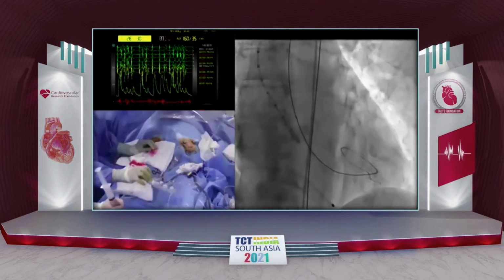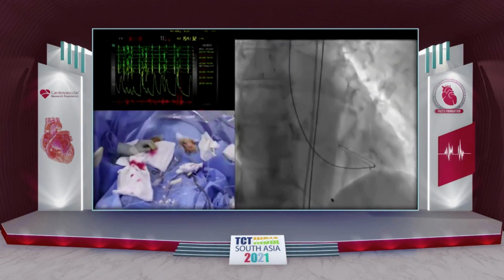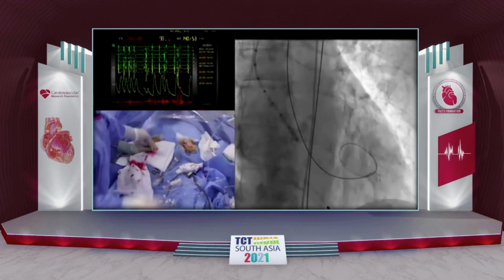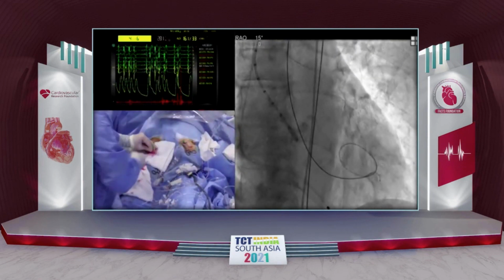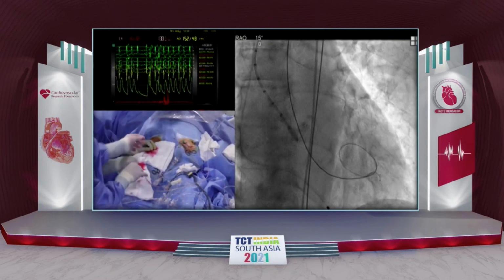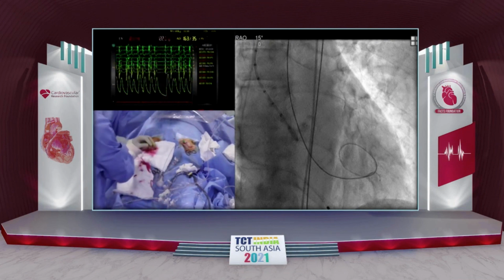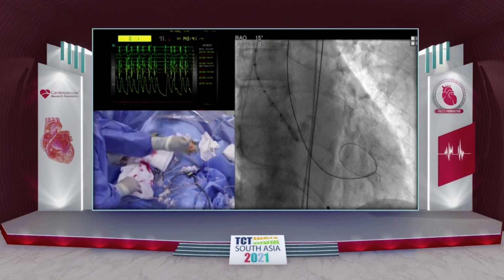He's a consultant cardiologist here. I have staff nurses who've been with us, really, 2 of them from the inception of TAVI in our unit. All our staff nurses are trained to give drugs if need be: phenylephrine, adrenaline, atropine. So they've all been licensed to do that. So we don't have an anesthetist in the room. But we are a trauma unit, so if I have to get an anesthetist in the room, it takes about 5 minutes.